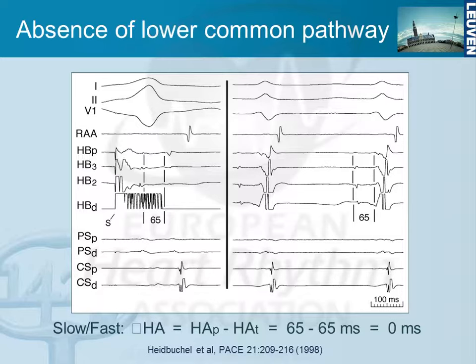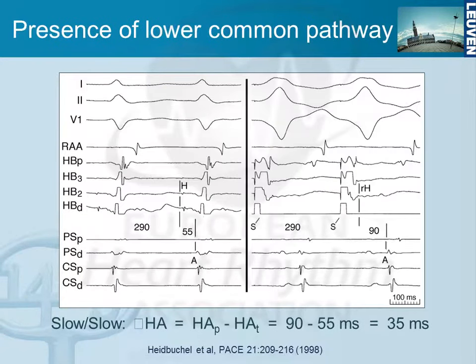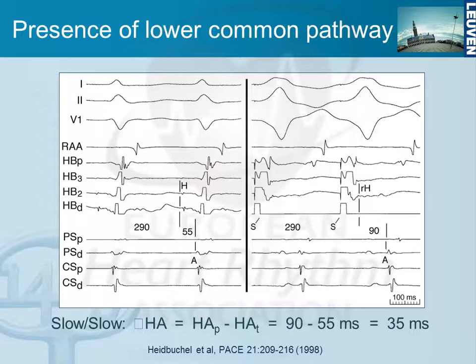Comparing HA during pacing and HA during tachycardia at the same cycle length: here we have tachycardia on the right, HA measured from beginning of HIS bundle deflection to beginning of atrial deflection is 65 milliseconds. With pacing at exactly the same cycle length, HA measured from the most proximal HIS bundle deflection to the beginning of the same atrial deflection is again 65 milliseconds. The difference — delta HA — is zero milliseconds, meaning there is no lower common pathway. In contrast to older textbooks, typical AVNRT has no lower common pathway; the turnaround point is exactly where it connects to the HIS bundle. In another example with short HA of 55 milliseconds during tachycardia but 90 milliseconds during pacing, the delta is 35 milliseconds — there is a lower common pathway — and earliest atrial activation is in the inferior septum, the proximal coronary sinus, consistent with atypical AVNRT.